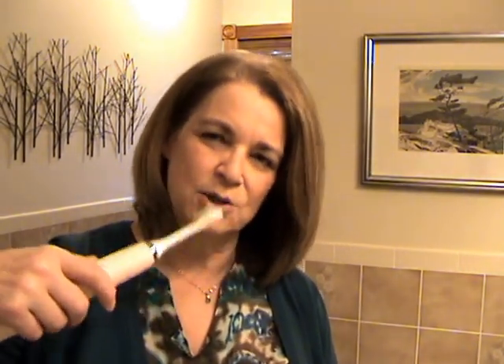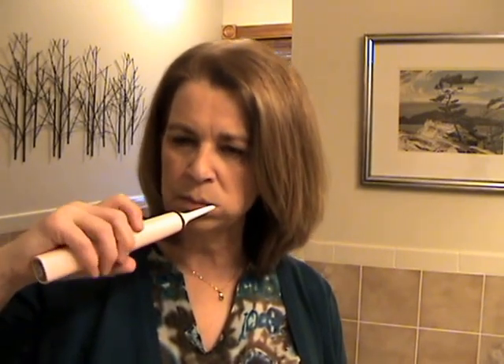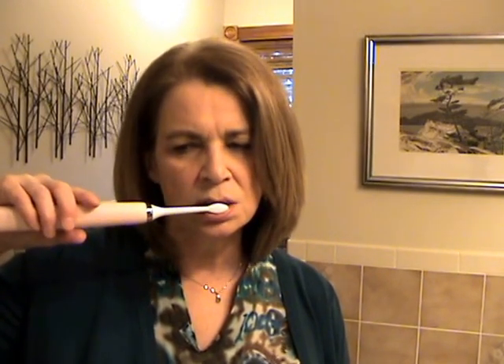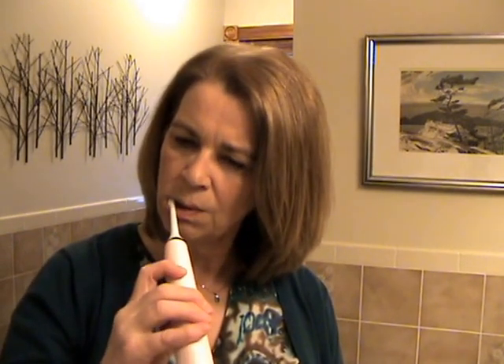Okay, here goes — I'm putting it on whitening, it's the second one down, and you're supposed to turn it on when it's in your mouth. Okay, I can already feel something happening.